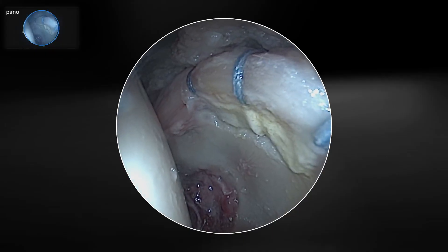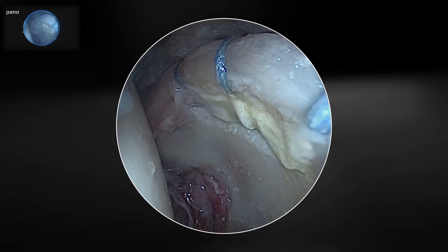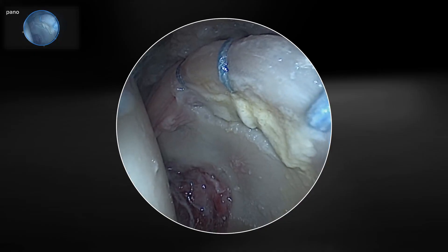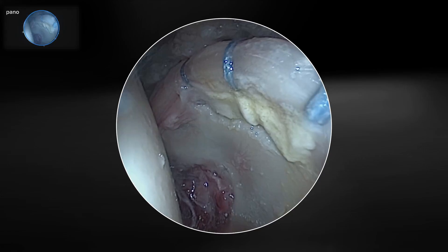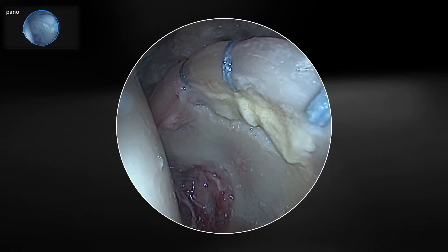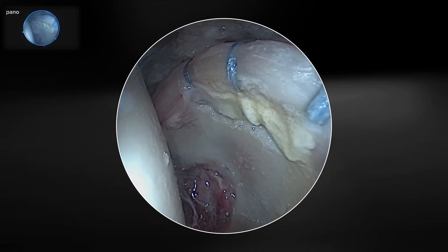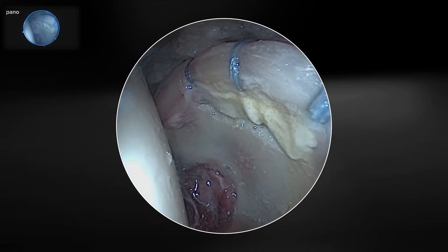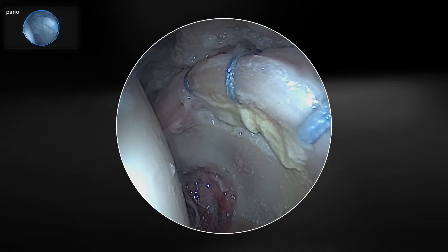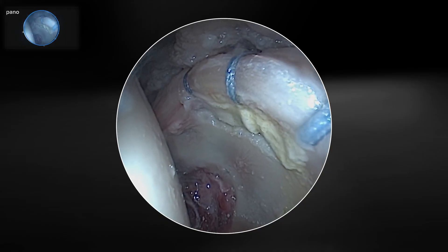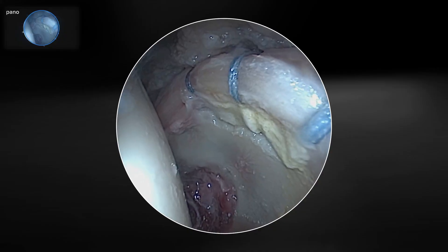That concludes our case. I like this approach very much because cam delamination lesions in the past have been unsolved for me — my approach was to simply leave them untreated. But this has given me a nice single stage approach with viable cartilage from the patient done at the same setting, and my hope is that this contributes to joint preservation and longevity for the future.